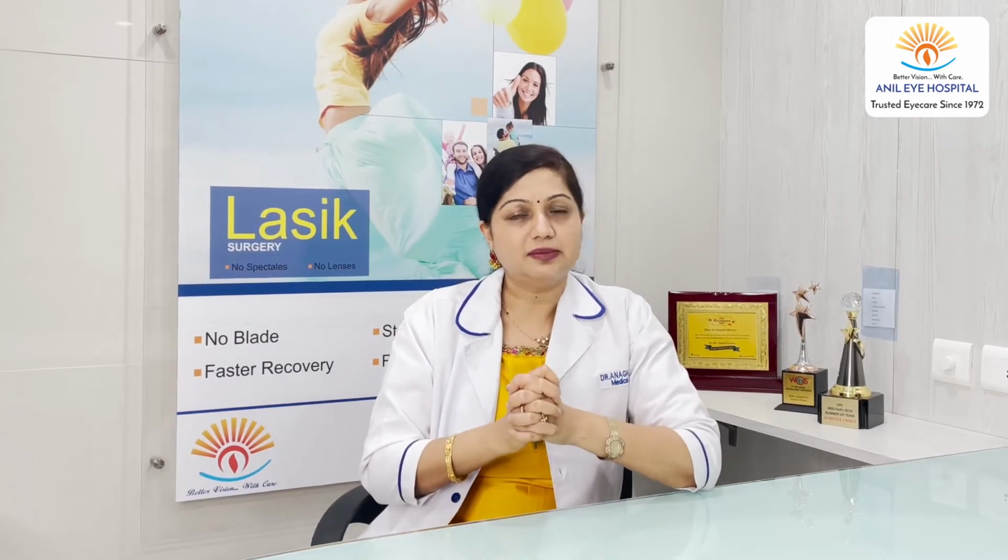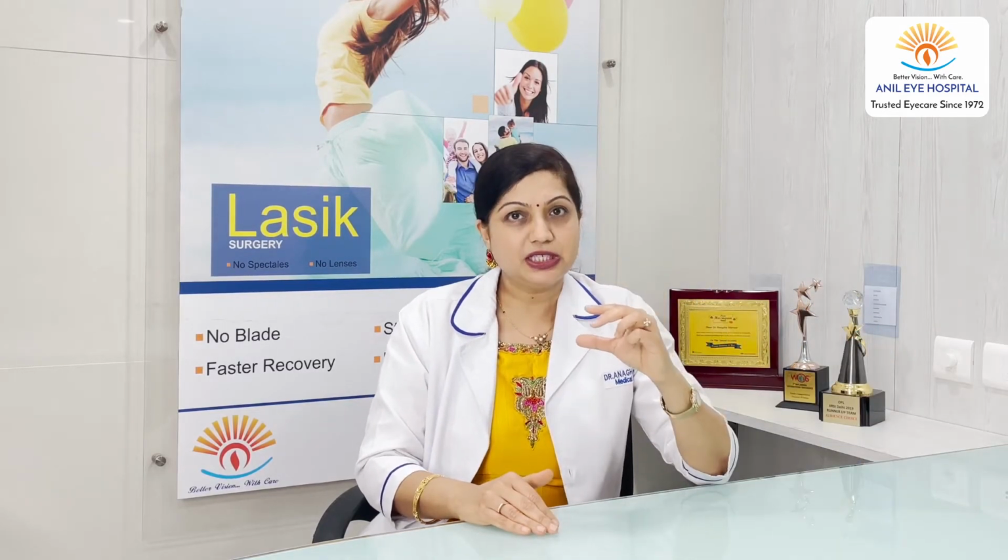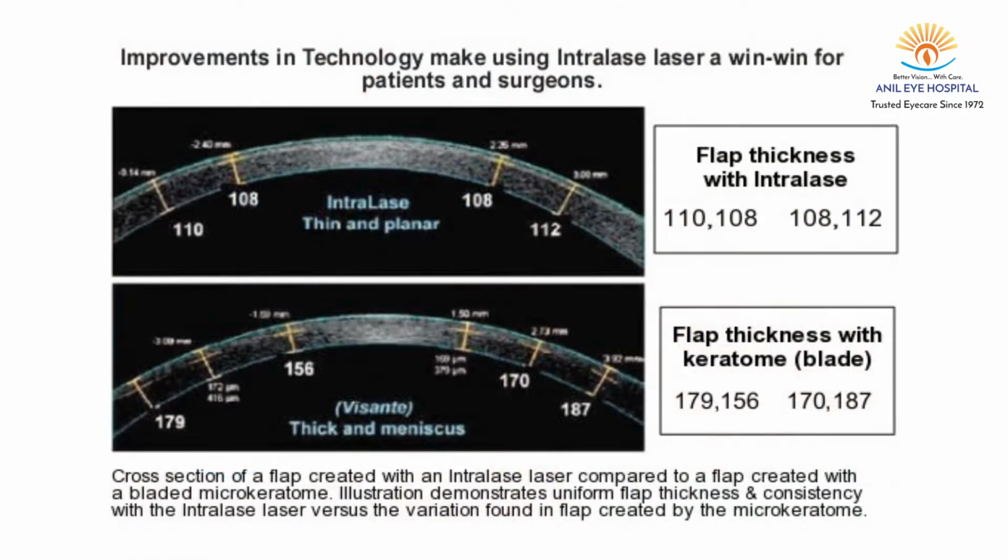Now, if you would ask me, what is the difference then between the flap of the blade versus the bladeless procedure? In the blade procedure, if you see the structure of the flap, it is thinner in the center and thicker in the periphery. That means it is not equal in all the sides. That is why sometimes this can have a higher incidence of flap related deformities.